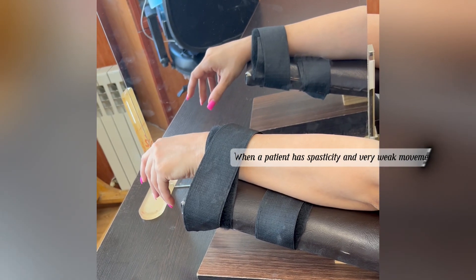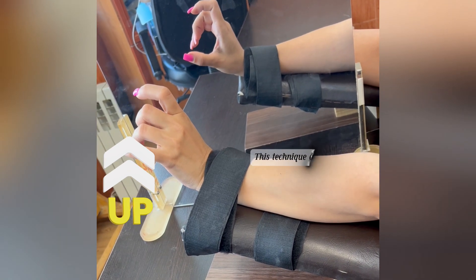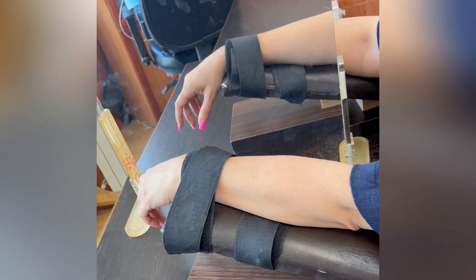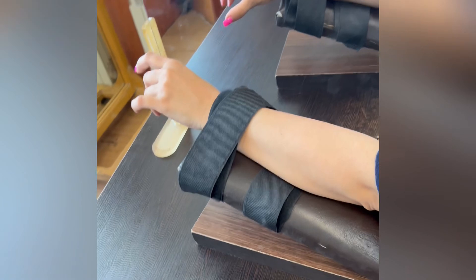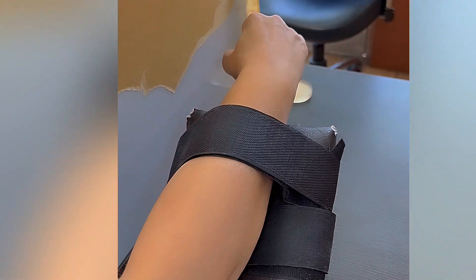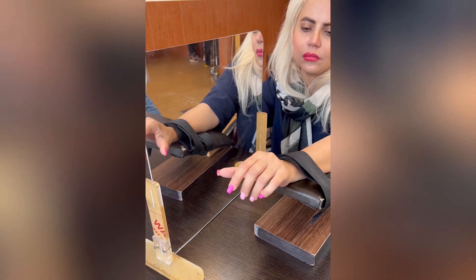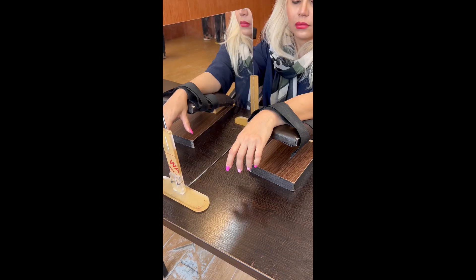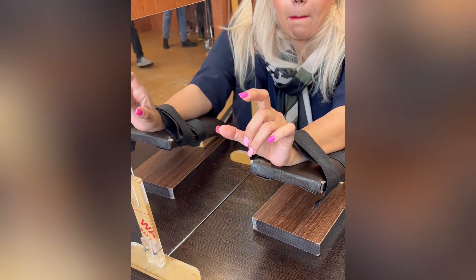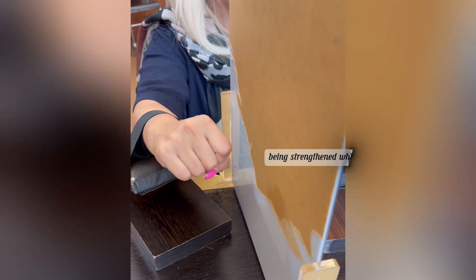When a patient has spasticity and very weak movement, we use an armrest to release tendons and induce tenodesis. This technique aims to address the increased muscle tone associated with spasticity. In this case, as you can see, the wrist extension movement is being strengthened while it is spastic.